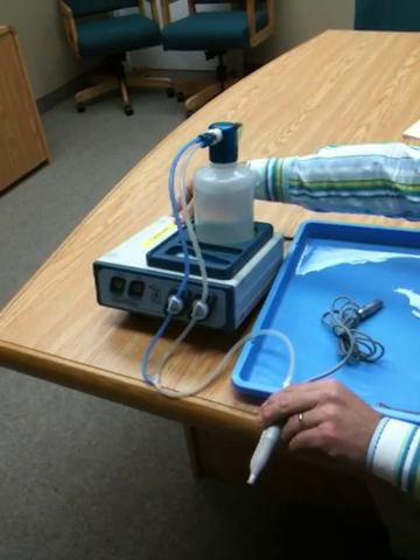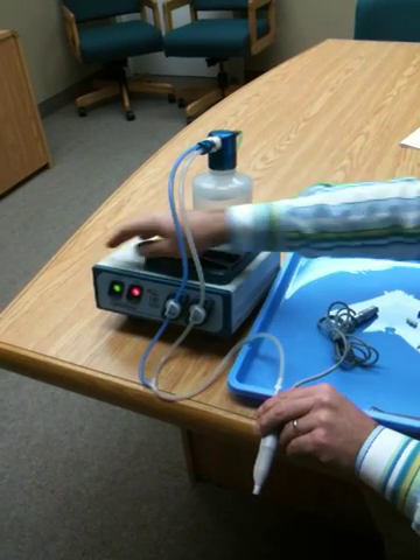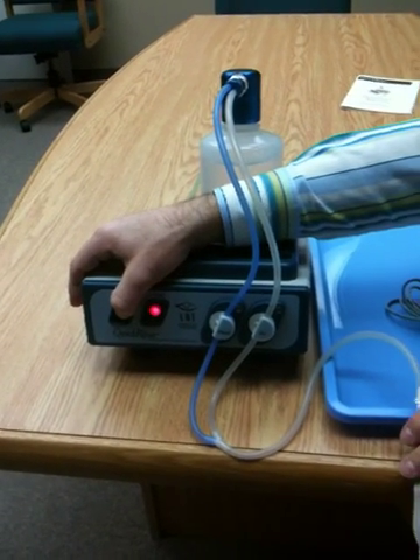First you'll turn on the unit — at the back of the unit there's an on and off switch. Then you'll press your cycle switch to get the automated cycle: 15 seconds of fluid and 15 seconds of air.